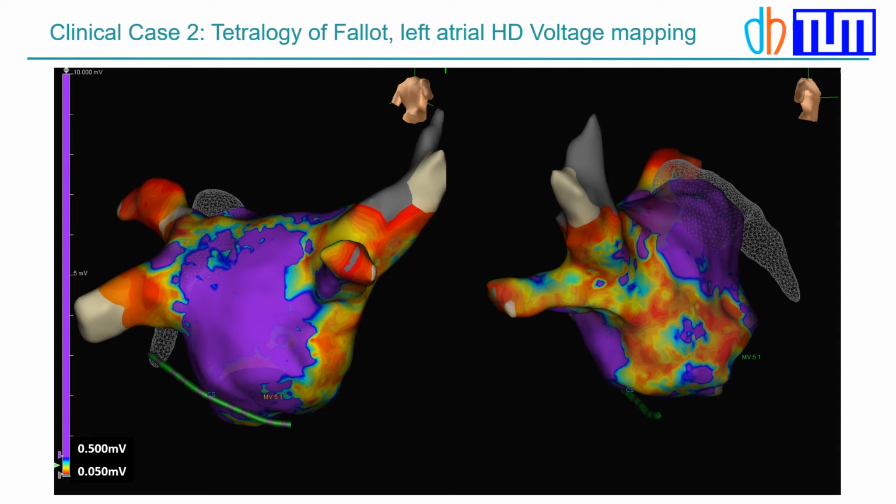And that is now the left atrial voltage mapping, again with this very high resolution. And what you can see is there is a line of block probably here on the roof line, which we drew twice. The pulmonary veins look isolated, and here is some very large scarring area on the anteroseptum of this lady here, if you look from the right lateral view.